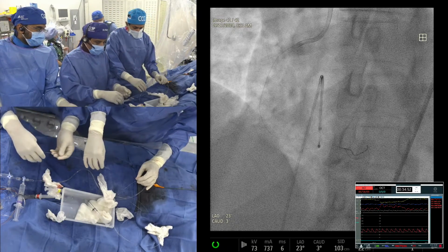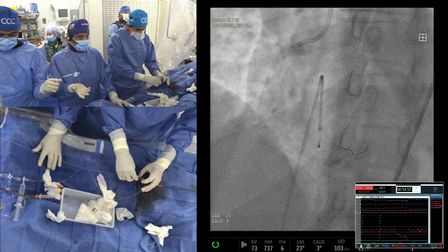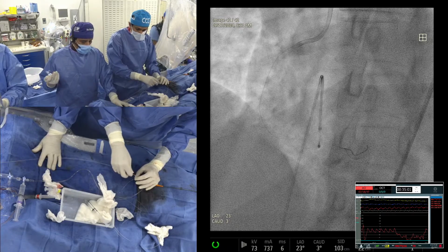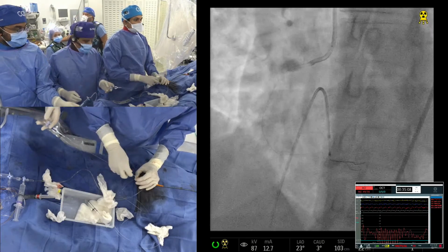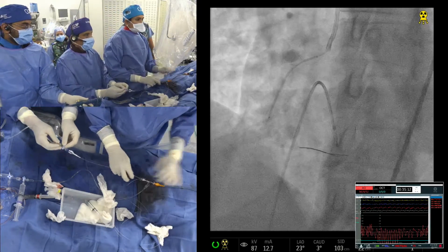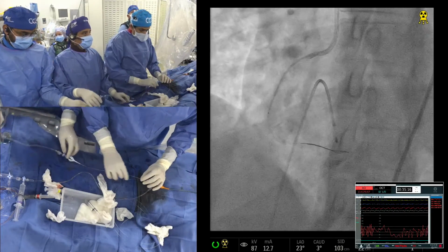If there is a questionable thrombus, whether it's a dissection, maybe. But when you see a clear-cut spiral dissection with decreased flow, you don't need any OCT or IVUS to tell you it's a dissection. I had a lot of argument about that when moderating live cases. Advancing imaging can also make the situation quite worse.